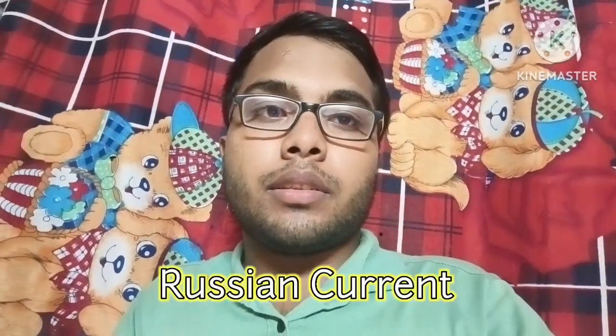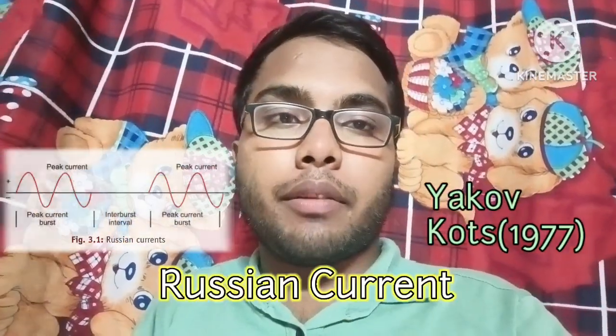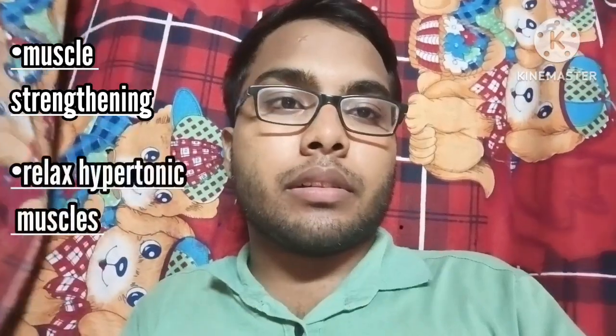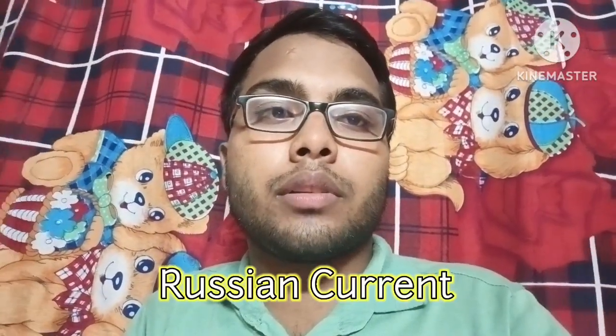The last on today's list is the Russian current, which was invented by the Russian scientist Dr. Yakov Kots. It is a high frequency current, and it is used to strengthen the skeletal muscle and also to relax hypertonic muscles. The Russian current has a frequency of 2400 to 2500 Hz.